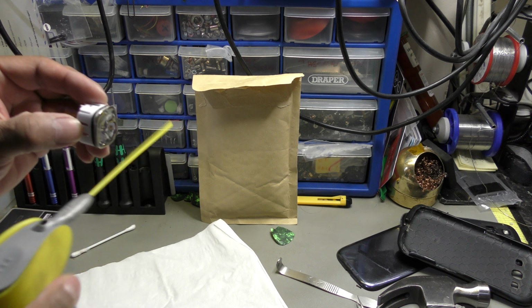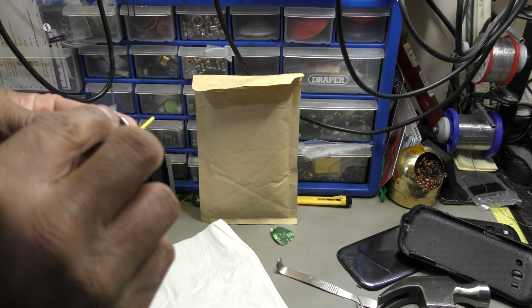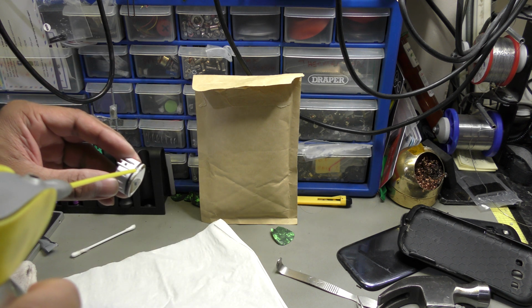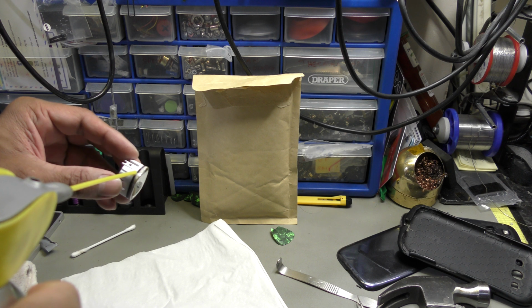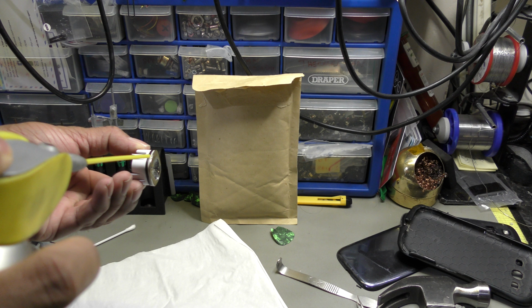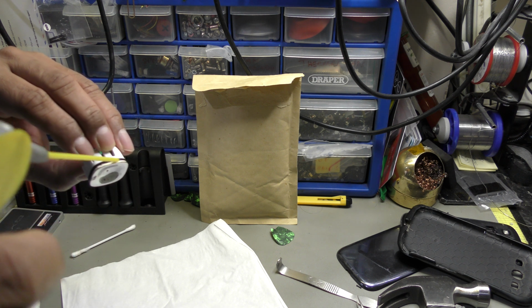Just make sure that the surface is clean, everything's clean. You will get a bit of clipping and chipping on the edges. I wouldn't worry too much about it. As long as you don't damage this seal, you should be absolutely fine. So that's what I've done. I'm going to apply it. Just make sure that it has gone around the seal.